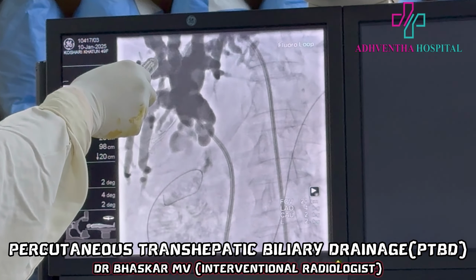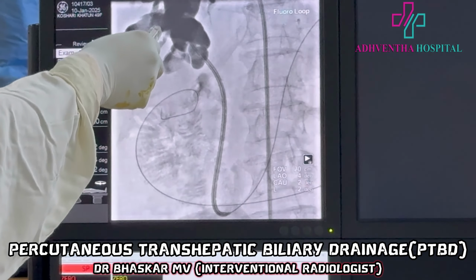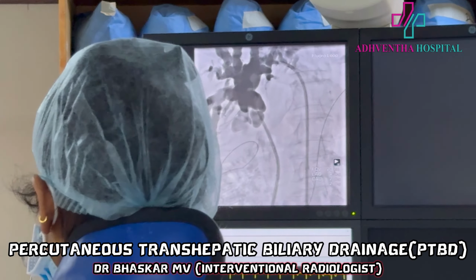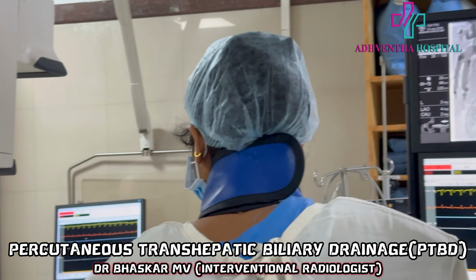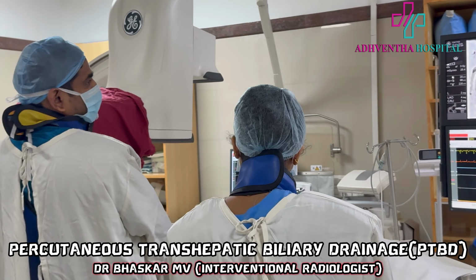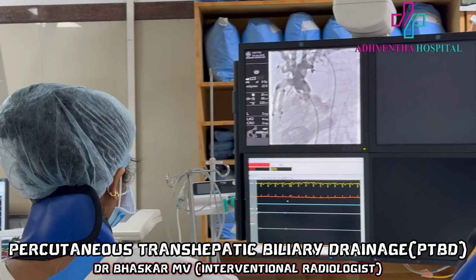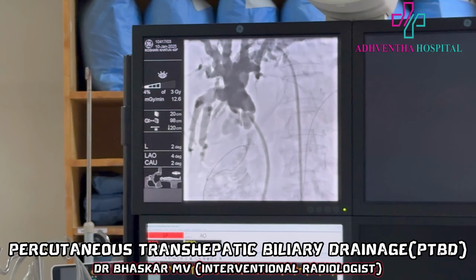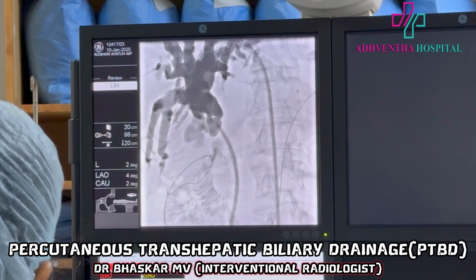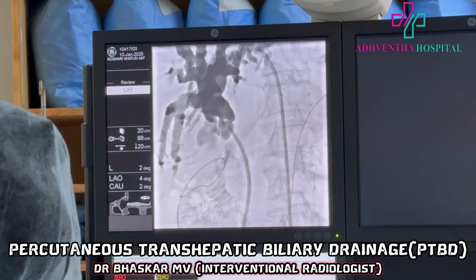So beyond that, all the holes will be there. So that should be inside the biliary tree. That is the trick here. Otherwise, leakage may occur into the peritoneum. Okay, this should be in the biliary tree. Now, the holes are there before the obstruction and beyond the obstruction, and the tip is in the duodenum.